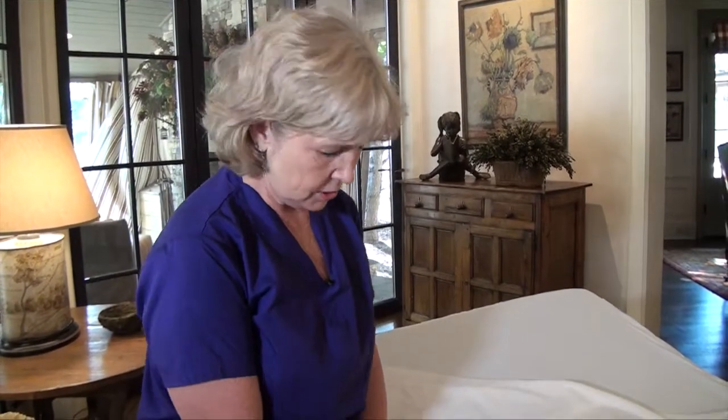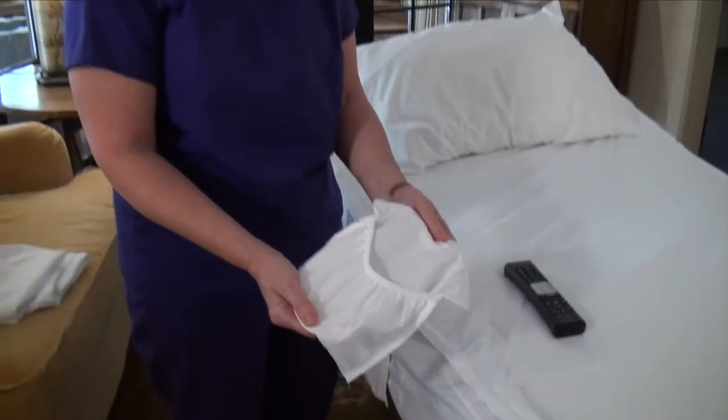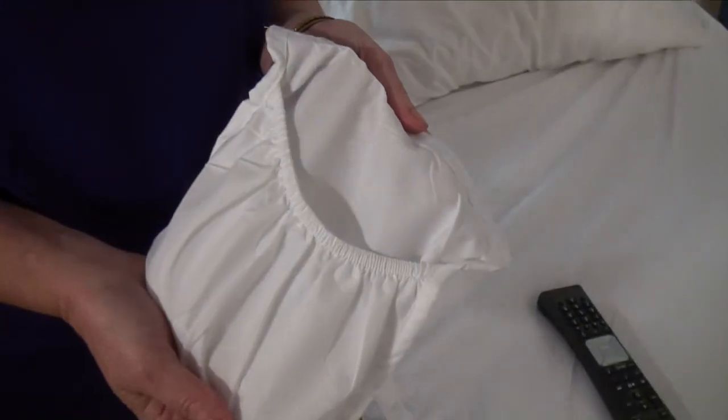Should this become soiled, this pocket comes right off. I can wash it and put it right back on, and I can put as many pockets on the bed as the patient has need to have her essentials by her bedside. It's that simple with Simple Sheets.